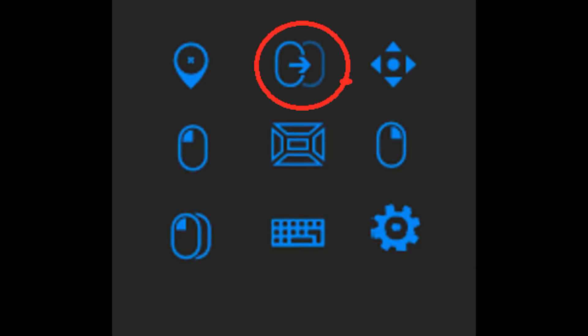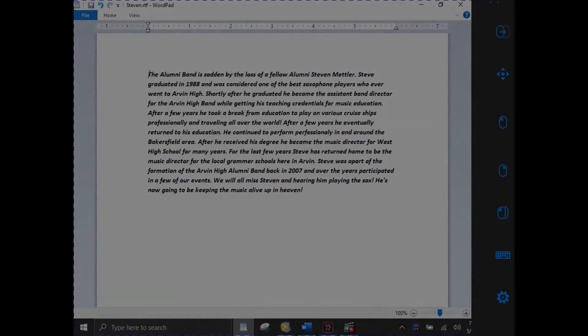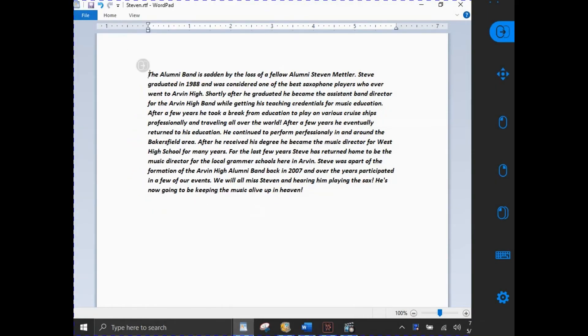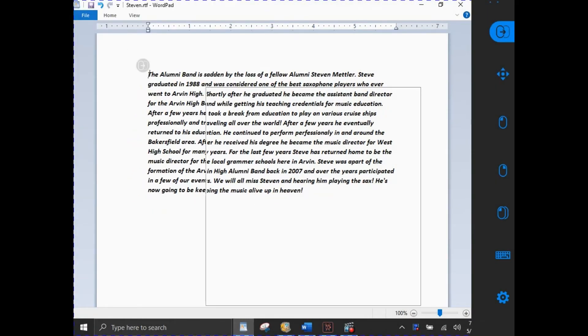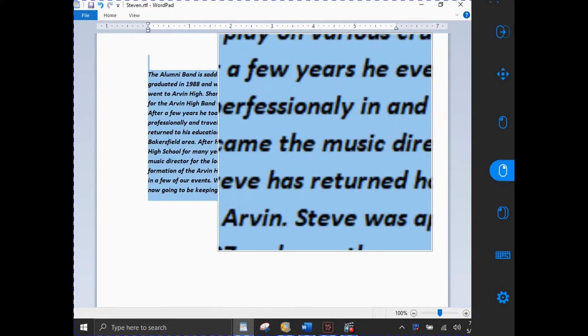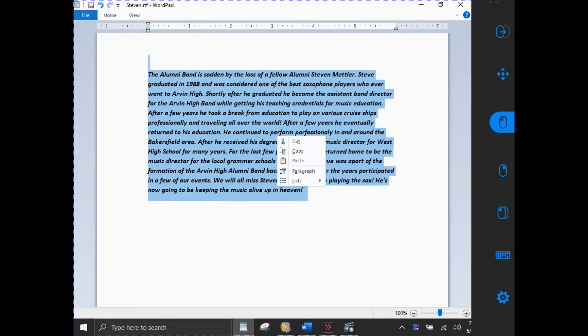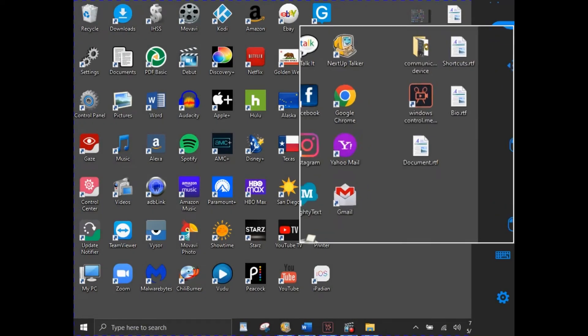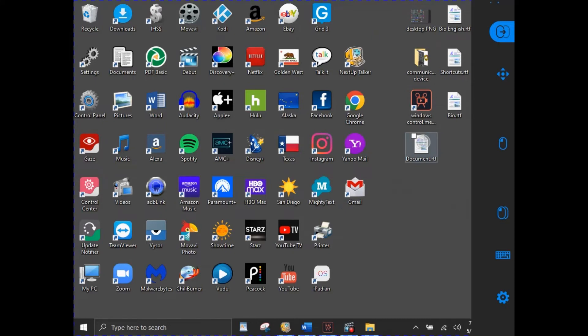The next icon is the highlight drag and drop icon. It looks like two ovals with a little arrow through them. You can use this feature to highlight an object or text — it's the same thing as holding the left computer mouse button down and highlighting, or to move files and folders to different locations. You can also highlight text to remove or relocate it.